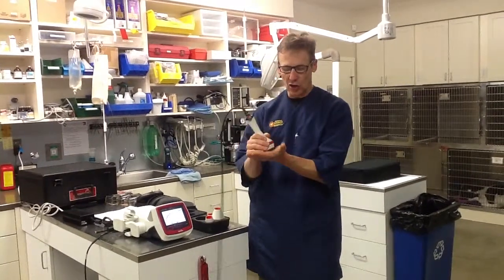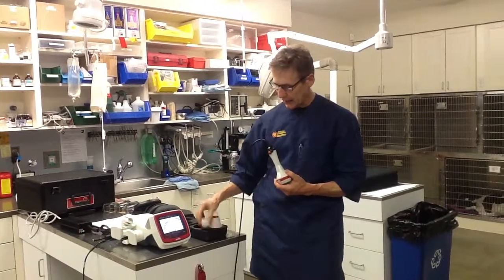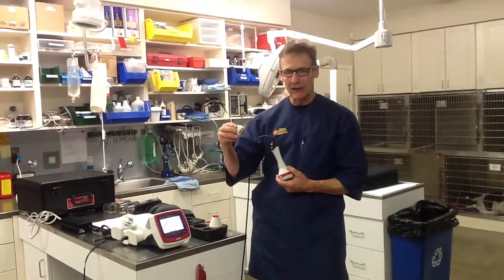So whenever you possibly can, use the contact head. You use the large contact head for above 6 watts. You use the small contact head for 5.9 watts or lower.